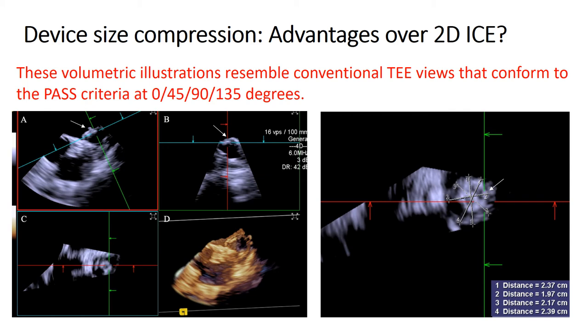Once 2D intracardiac echo imaging measurements are complete, proceed to volumetric analysis. The main advantage of 4D ICE over 2D ICE is the ability to create real-time multi-planar reconstructions or MPR images with cross-sectional planes at coaxial orthogonal projections, with and without color Doppler overlay. Real-time MPR layout views at orthogonal en-face projections of the Watchman device allow precise measurement at the level of the shoulders to evaluate compression throughout the 360-degree circumference of the closure device from a single imaging projection.